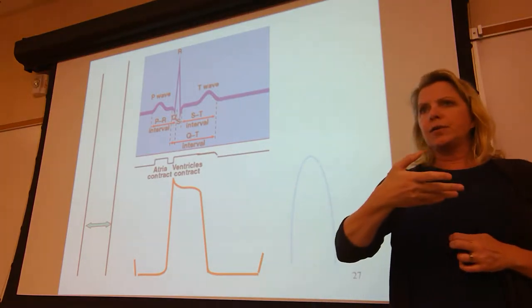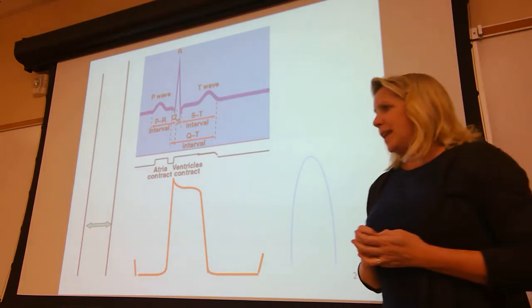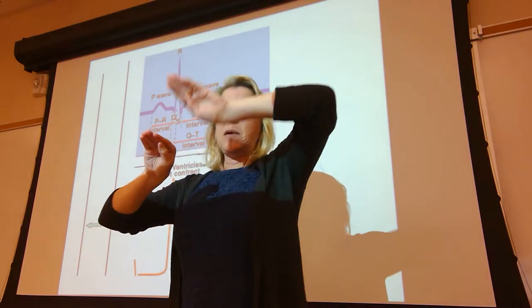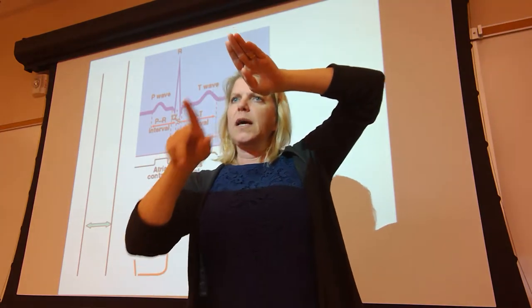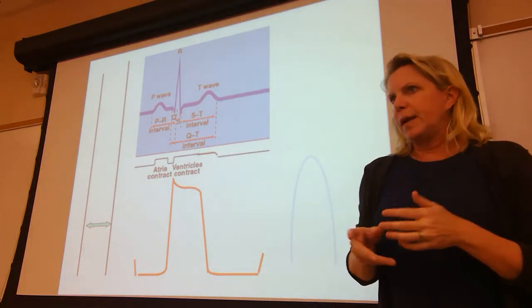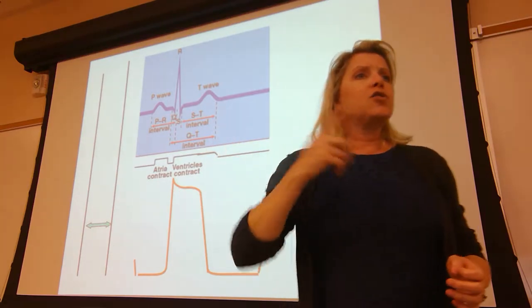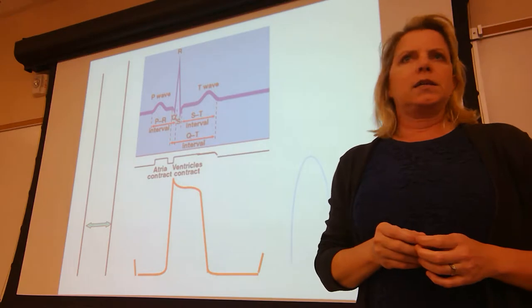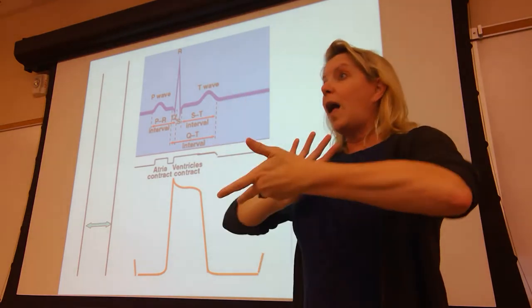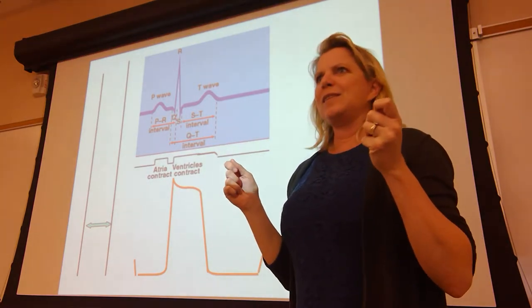Inverted. Now, in the Tuesday, Thursday class, and there are three of you in here, poor Rachel, when we were doing our analyses of the EKG, remember on Monday, I taught you how to draw your baseline, your best fit line, and you had to measure the upward deflection and subtract away from it the downward deflection and take the algebraic sum. Well, she started analyzing leads 1, 2, and 3 to get her algebraic sum, and lead 2 was where we started. I said, now find your R. It should be an upward deflection. You remember what she said? She went, it is not. And I said, it should be. She said, it's not. So everything was flip-flopped for her EKG, and she was the one that said, I think my lab partners put on the leads backwards.